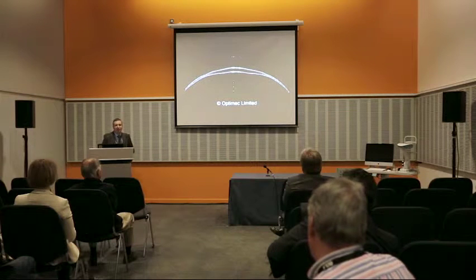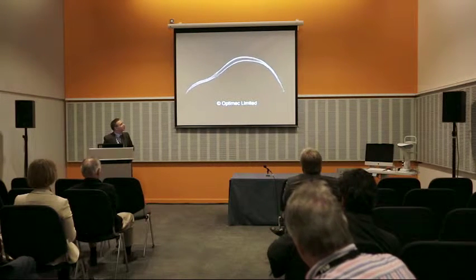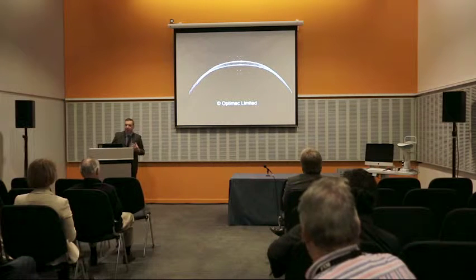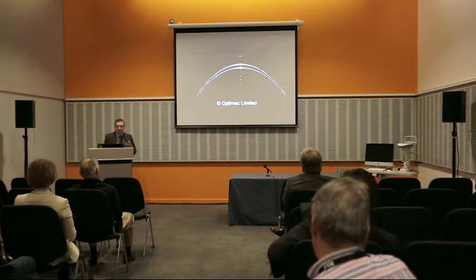It's doing a kind of funky dance. Now, when you understand that manufacturers, for certain lenses, make them in a dry state and they go through this hydration process, they are not necessarily able to accurately measure and determine what the parameters are within the lens once it's finally hydrated.